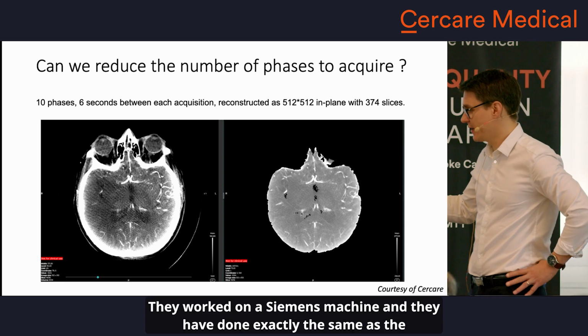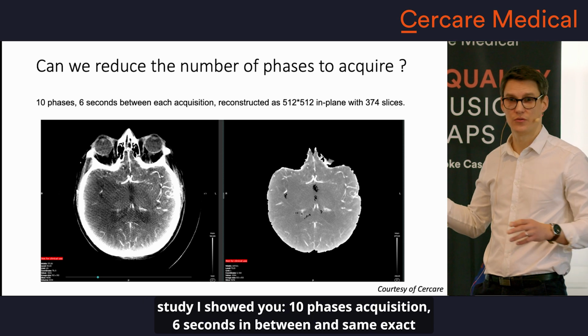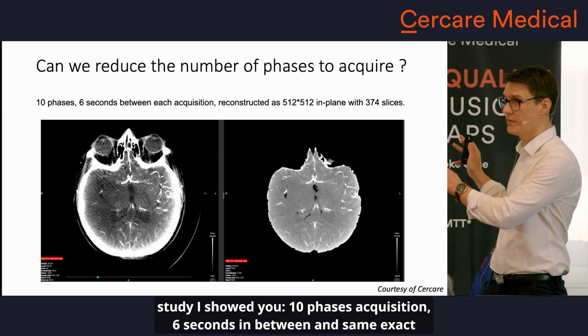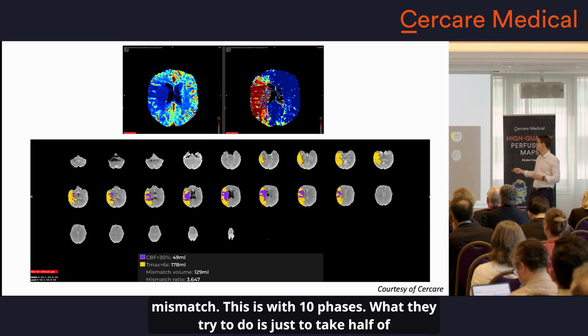They worked on a Siemens machine, and they did exactly the same as the study I showed you: 10 phase acquisition, 6 seconds in between, and exactly the same reconstruction. They got quite a precise evaluation of the mismatch. This is with 10 phases.